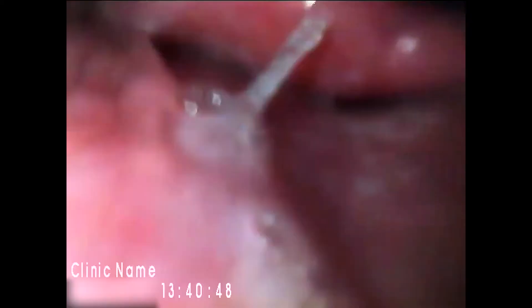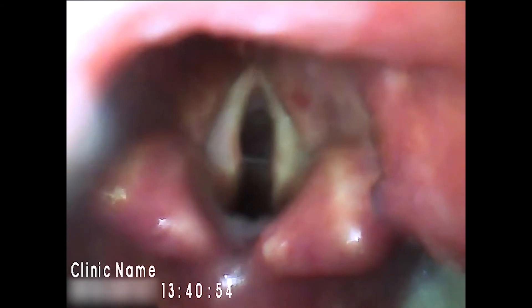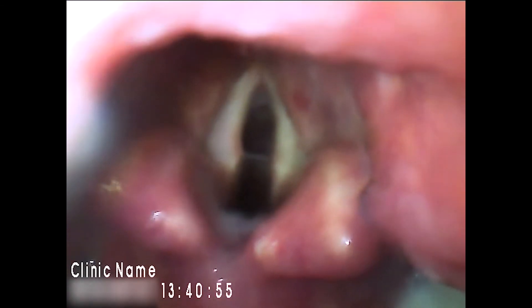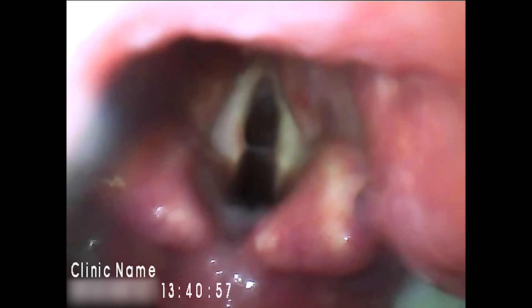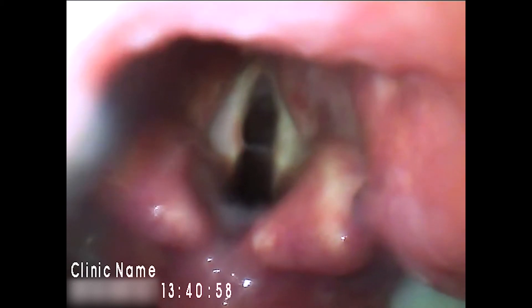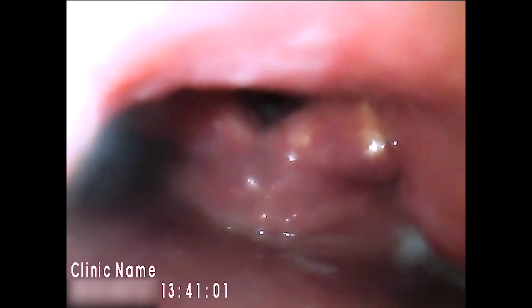This video gives a good example of how blind spot injury can occur. However, the video laryngoscope is too deep in the airway, allowing limited view of the tissues proximal to the larynx.